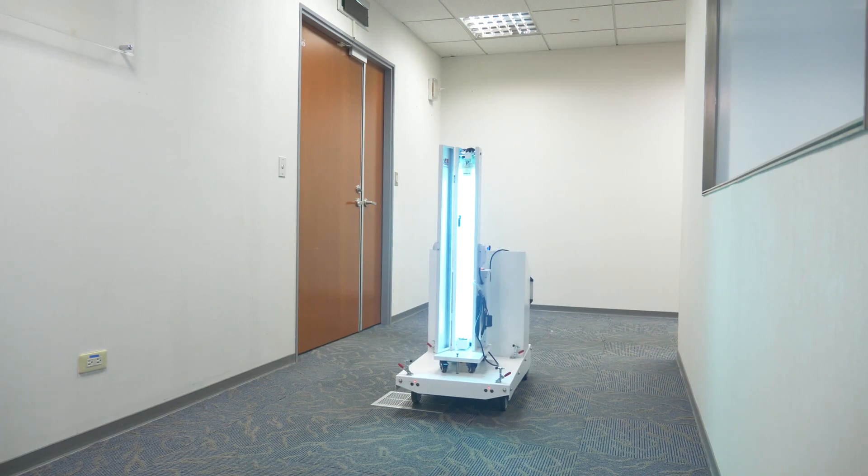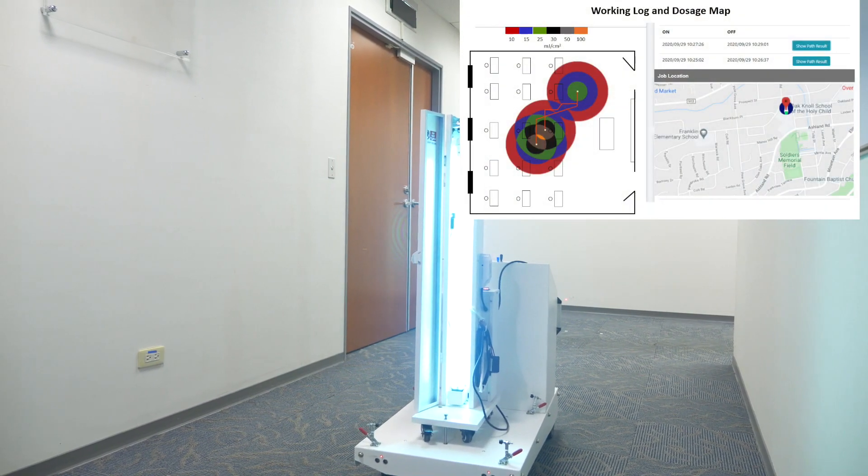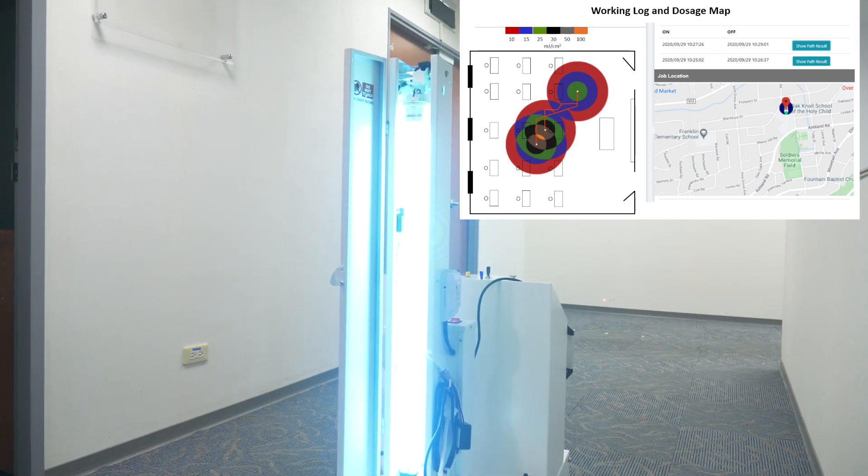The Cello UVC robot can record the tracking record of each disinfection trip and generate the working log and dosage map on its Cello UVC cloud.